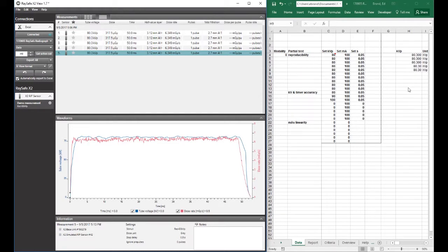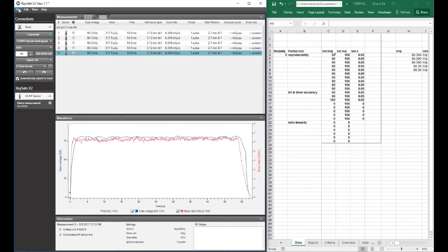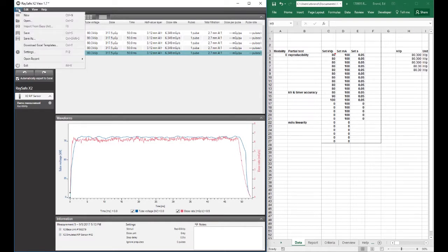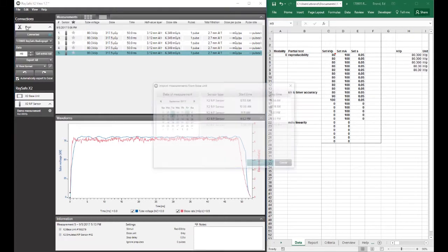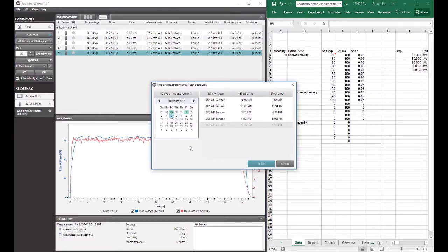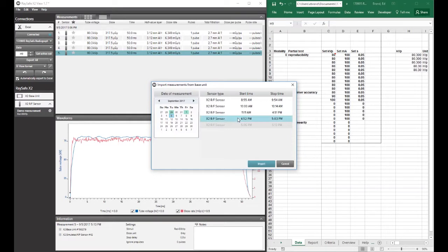So if I go to file and import from base unit, now I can import from the base unit. And I'm going to select today, September 5th. And I had a session here. I'm going to just import the data from that session.